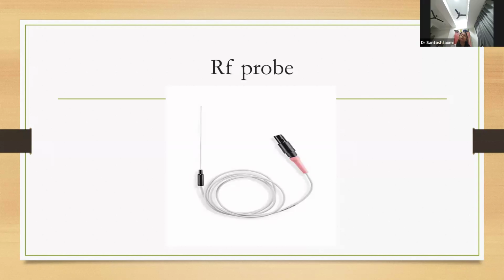Okay. How is heat generated? It is because it creates a current and there will be to-and-fro movements of cations and anions. There will be friction, and that friction will generate the heat, the thermal energy. The thermocouple does not generate the temperature or thermal energy, but whatever temperature you set, it senses the tip temperature and sends a signal back to the machine, and then the machine adjusts its voltage or changes its temperature. Correct? Yes. Fantastic.